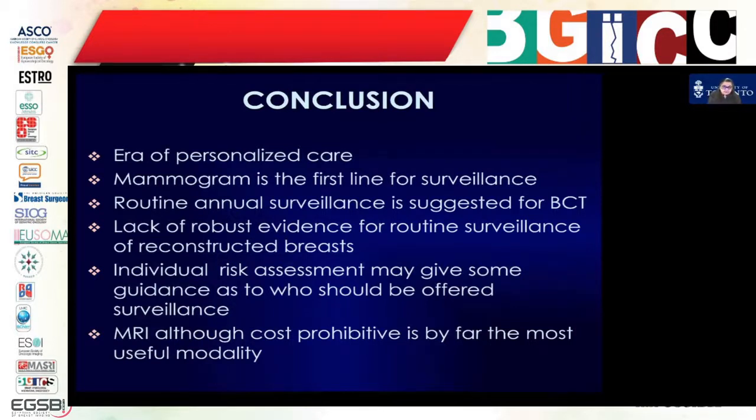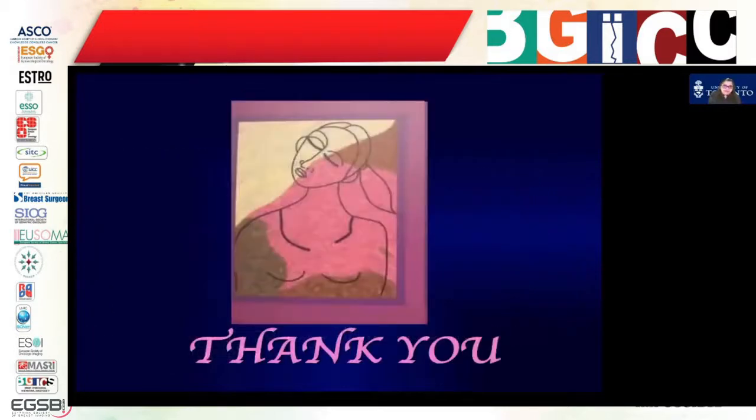mastectomies. Although MRI is cost prohibitive, if at all you want to offer one test for breast, a reconstructed breast, it is by far the most useful modality and also helps us in looking at the implant and the deeper tissues and the complications. So I want to thank you for attending this talk.